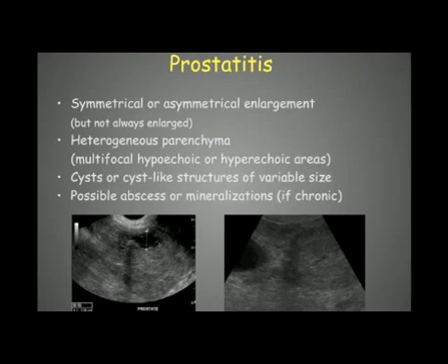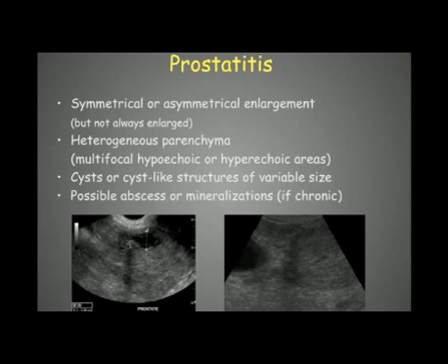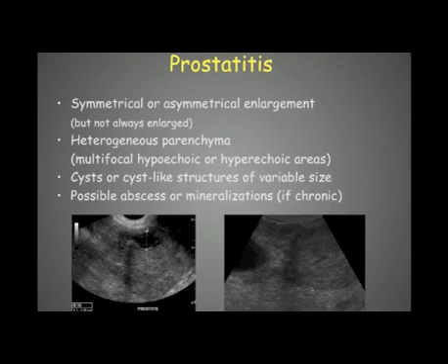Cysts greater than one centimeter may represent abscesses. We can also see mineralizations, but only if the prostatitis is chronic. In this example we see mineralization within the prostate in a case of prostatitis with abscess — signs of chronic disease. The surroundings of the prostate are not clear; it is surrounded by a hypoechoic region and hypoechoic fat, indicating inflammation around the prostate.